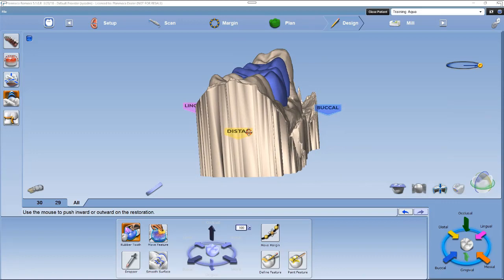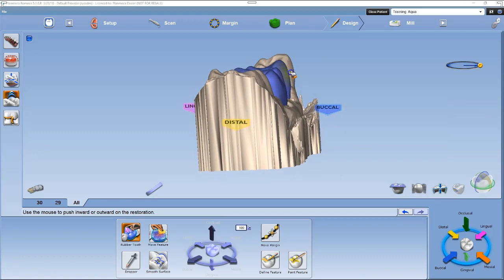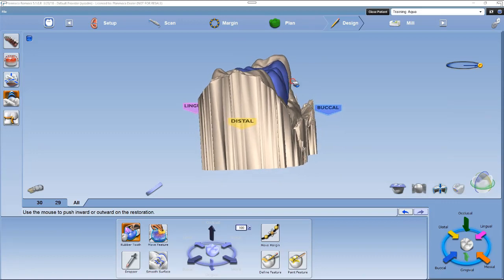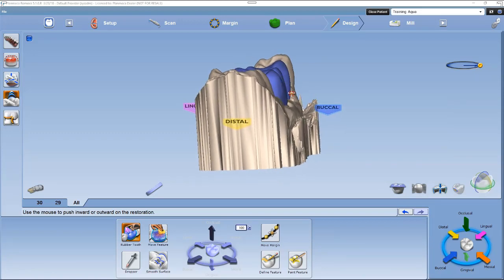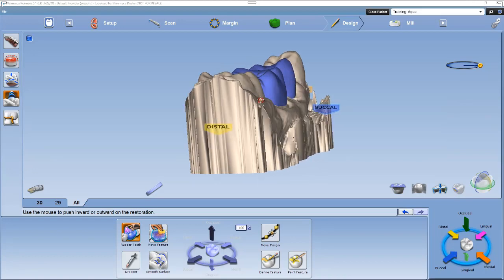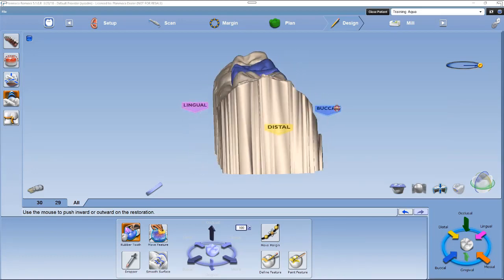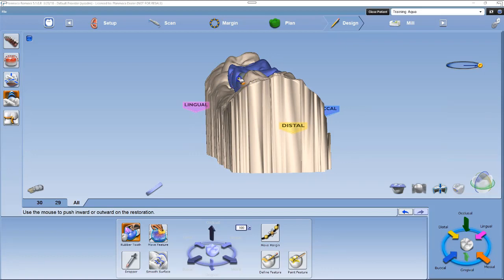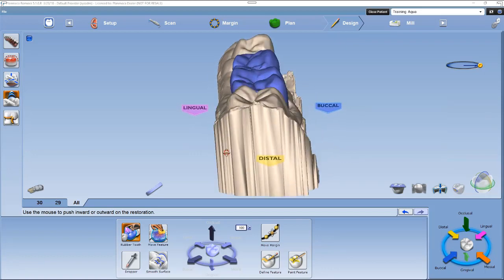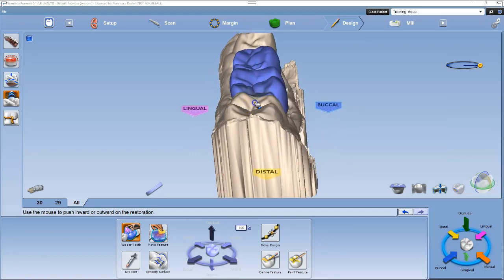The third step: left-click the distal arrow in the quick view circle. Do three slight rotations. First, evaluate the buccal contours — these should follow the same as the neighboring teeth. Second, a slight rotation to evaluate the lingual contours. The third rotation in the distal view is to evaluate the distal marginal ridge, which should be at the same height as the distal neighbor's marginal ridge.